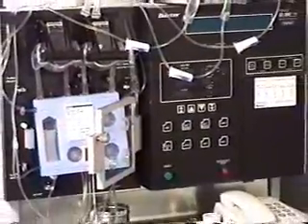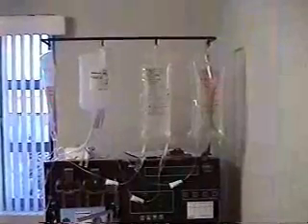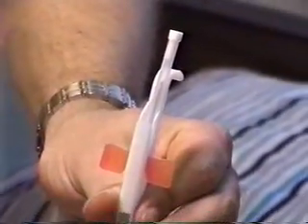Going close. Take a look at these connectors, because they look very impassive and plain. So those are the syringes.